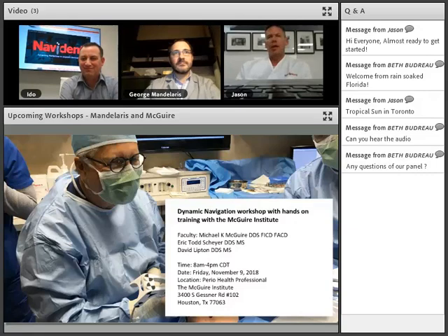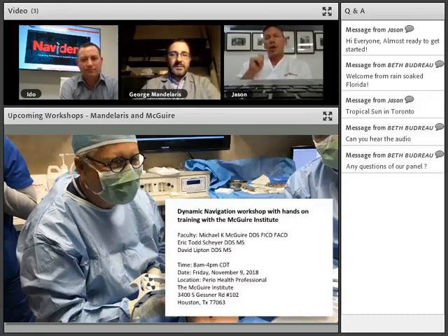One thing, George, just while we're talking, some people love using the head tracker for maxillary cases. Sylvia, for instance, is one who would prefer to use the jaw tracker, same as for the mandible, in the maxilla. I know you haven't done that yet. Do you see any advantage in that for you?